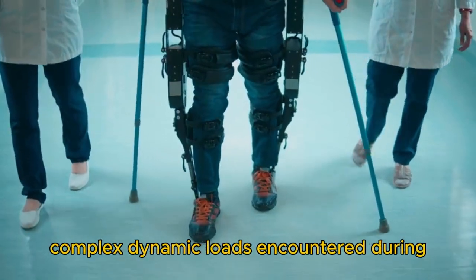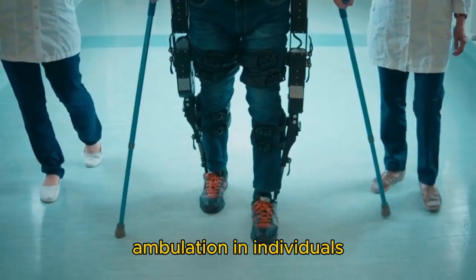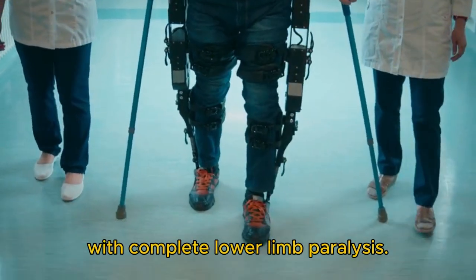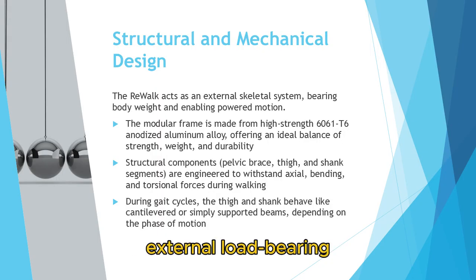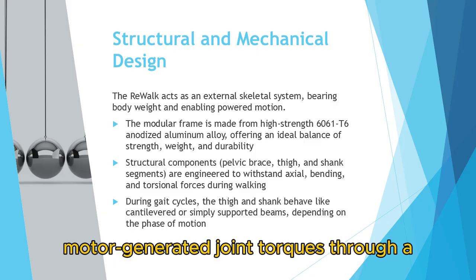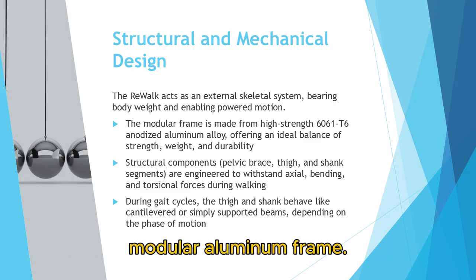The ReWalk Personal Exoskeleton is engineered to withstand and efficiently transmit complex dynamic loads encountered during ambulation in individuals with complete lower limb paralysis. The device functions as an external load-bearing structure, transferring body weight and motor-generated joint torques through a modular aluminum frame.